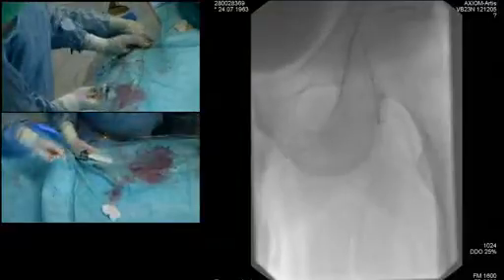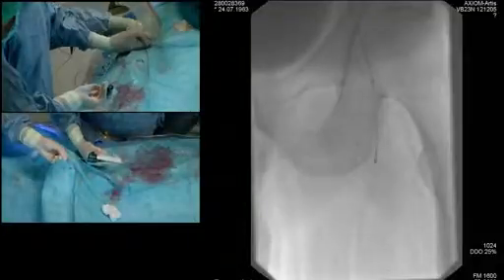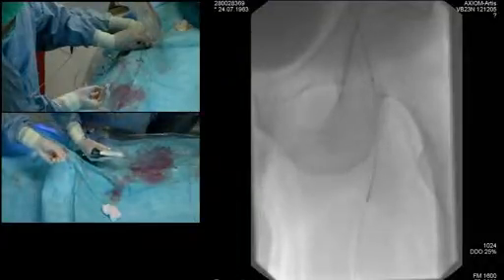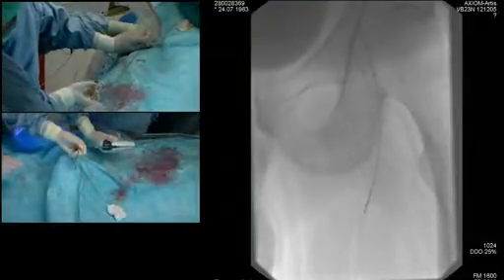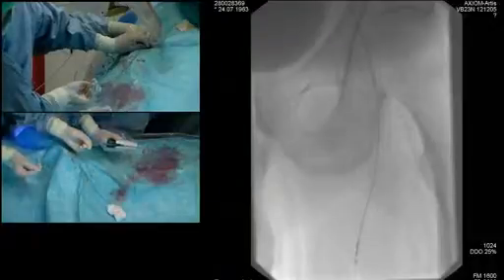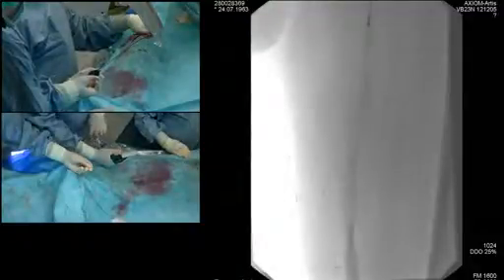So can you comment on the size? 6 or 8 French system? I think this is a very important question. This is a bypass with a diameter of 8 millimeters. For this size, it's definitely better to use an 8F approach. But in this case, it was very, very difficult for crossover, so that's why we had to use the 6 French Rotarex device. Of course, 8F is the preferred size of this catheter for this bypass indication. I would really recommend, if it's possible anyway, to use an 8 French system. In this case, we were forced to use 6F because of the problems with the crossover maneuver.